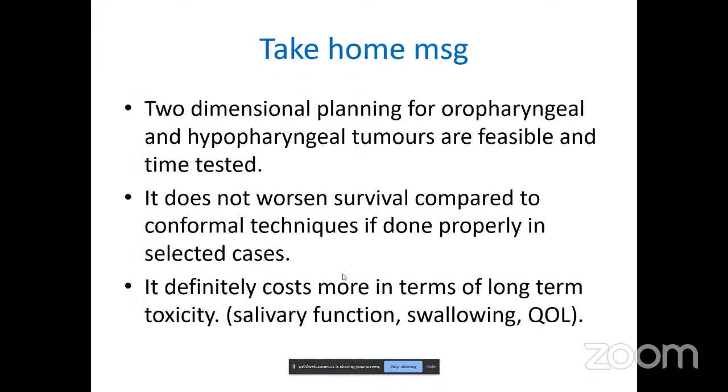So for the take home message, two-dimensional planning for oropharyngeal and hypopharyngeal tumors is feasible, and it is well time tested. It does not worsen survival compared to conformal technique if done properly in selected cases. So it is absolutely feasible, but it definitely costs more in terms of long-term toxicity. When you talk about salivary function, swallowing, quality of life, definitely there is a drawback of the 2D planning system. That's why we will discuss 3D as well.